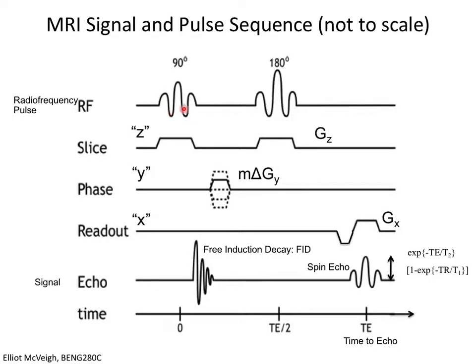So if this is 64 megahertz, and the only thing that's going to elicit a signal from the patient is something at 64 megahertz, because that's my RF, then when I turn that gradient on and look through my patient, there will be one plane that is resonant at 64 megahertz. If it's up towards their head, the spins would resonate at a higher frequency.